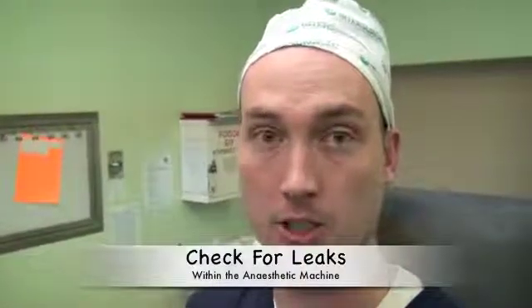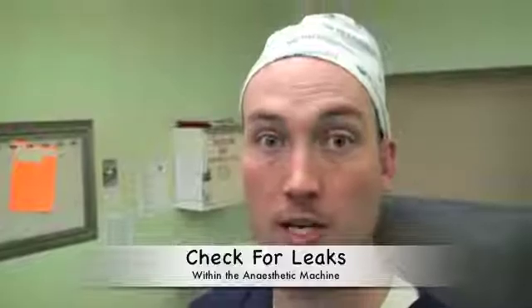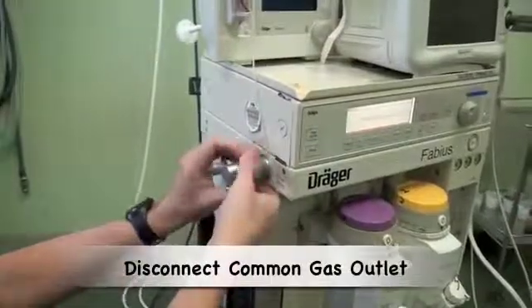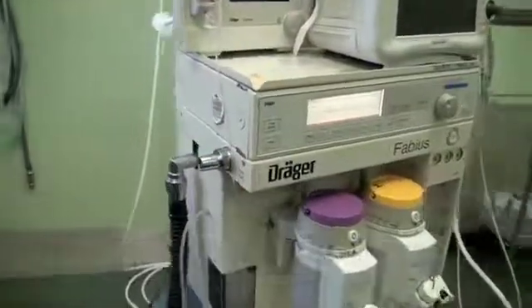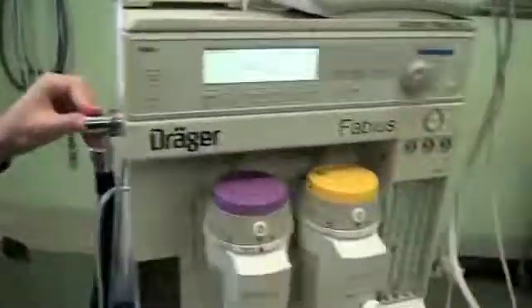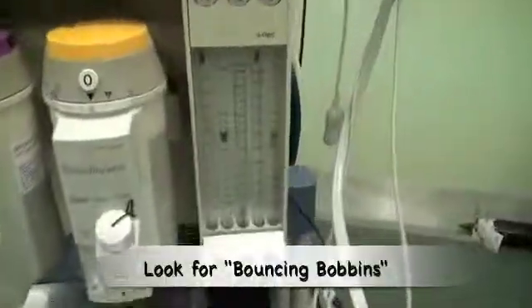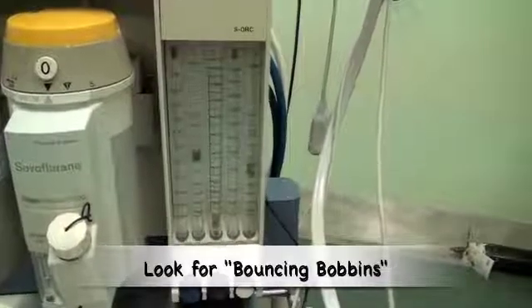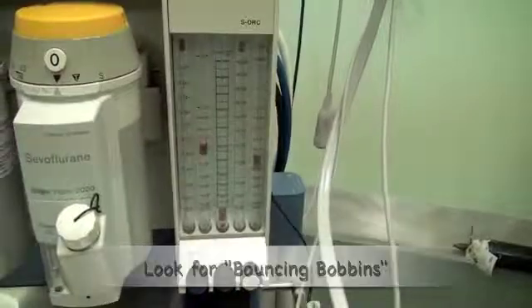Now that we have checked that we have a supply of gas to the machine, we need to check for leaks within the machine. On the Fabius machine, this is done by disconnecting the common gas outlet. One then occludes the common gas outlet and watches the bobbins on the rotameters to ensure that they are bouncing up and down, which indicates that there is no leak.